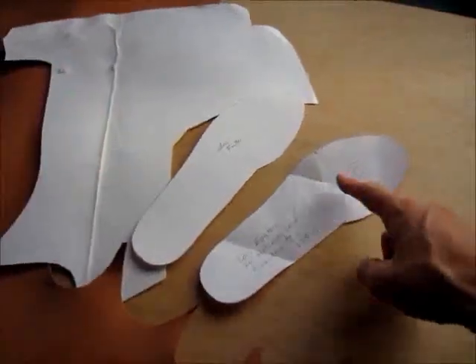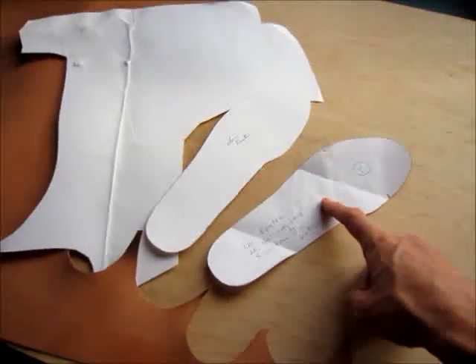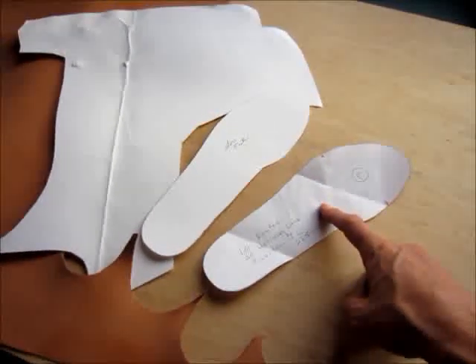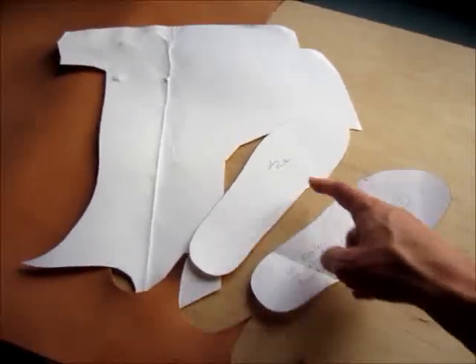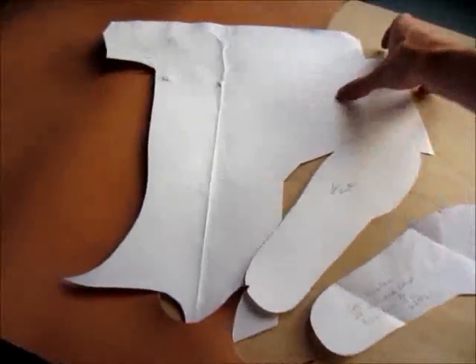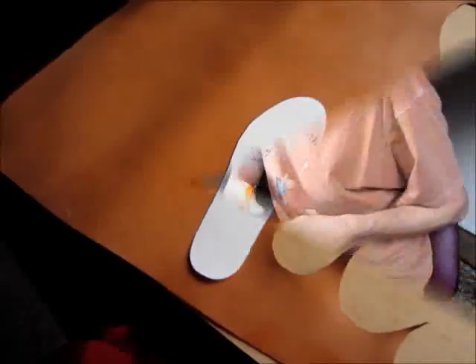So now I take this paper pattern that the customer sent me — they created that from the insert from their shoe that they want the orthotic to fit in — and I make a heavy paper pattern from some heavy paper, and then I use that to make the leather pieces for the orthotics.